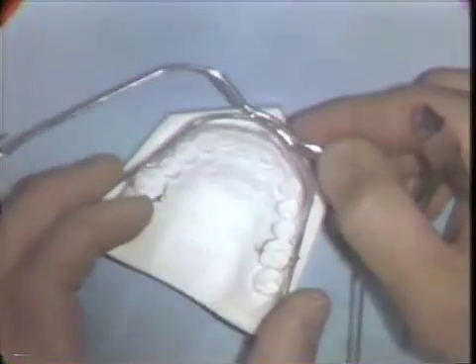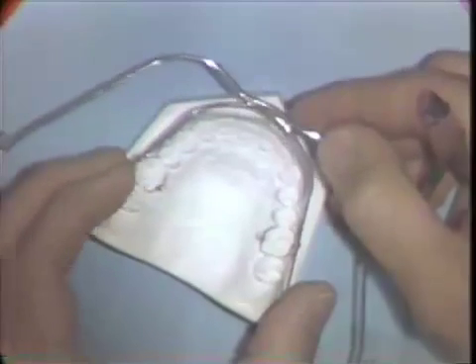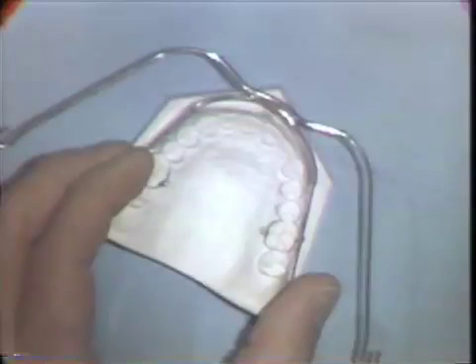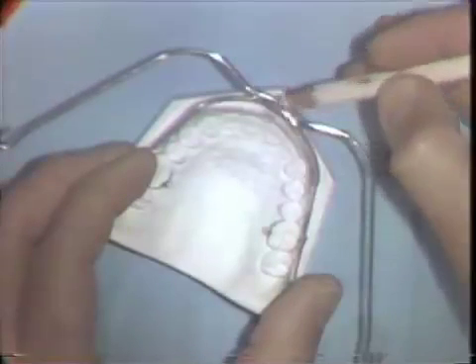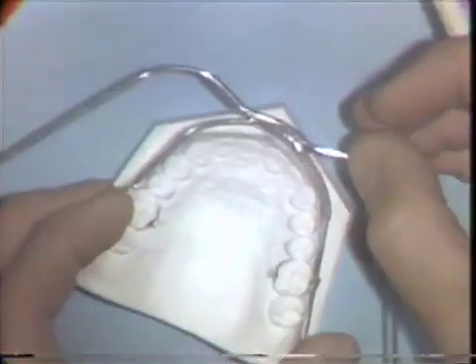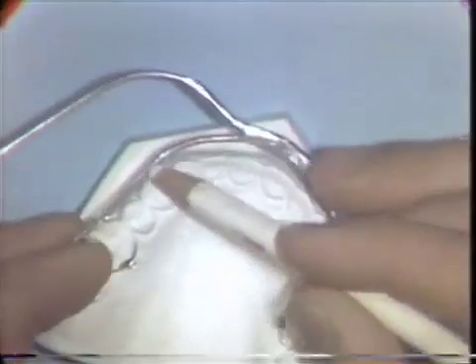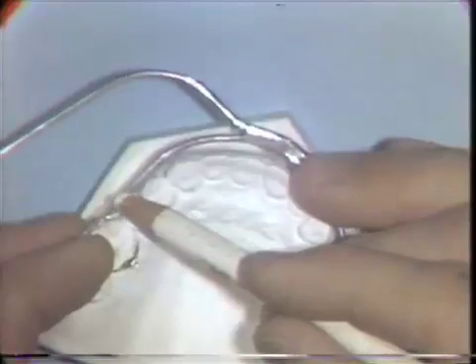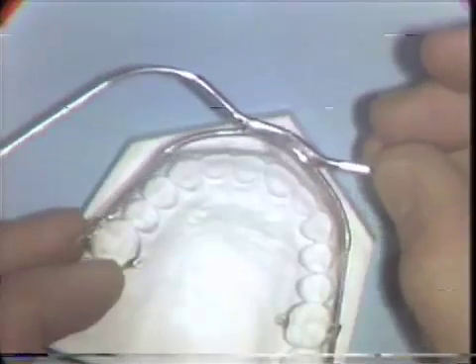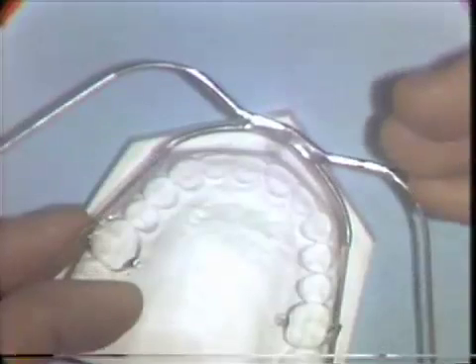The wire sweeps to the distal. It should be adapted to be 5 to 6 millimeters away from the incisor teeth, and it should be about 2 to 3 millimeters away from the labial surface or buccal surface of the bicuspid teeth.